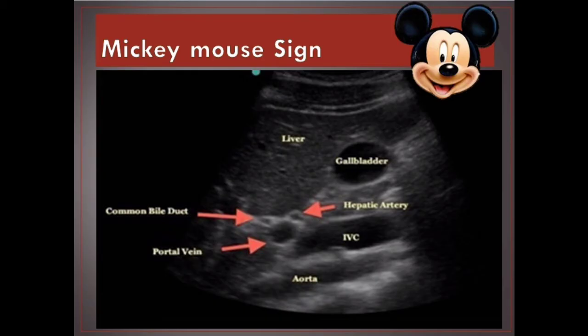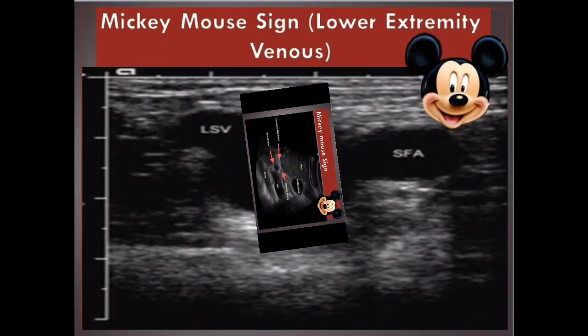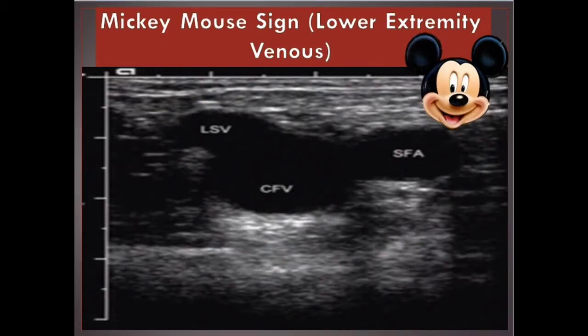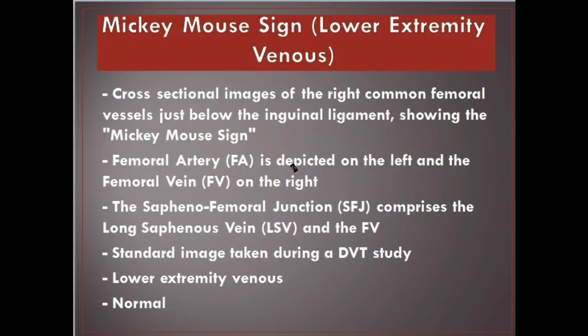Mickey Mouse sign. It represents the appearance of the portal vein, common bile duct, and hepatic artery. Also used for lower extremity venous imaging — cross-sectional images of the right common femoral vessels just below the inguinal ligament showing the Mickey Mouse sign. The femoral artery is depicted on the left and the femoral vein on the right. The saphenofemoral junction comprises the long saphenous vein and the femoral vein, as seen in a standard image taken during a DVT study.